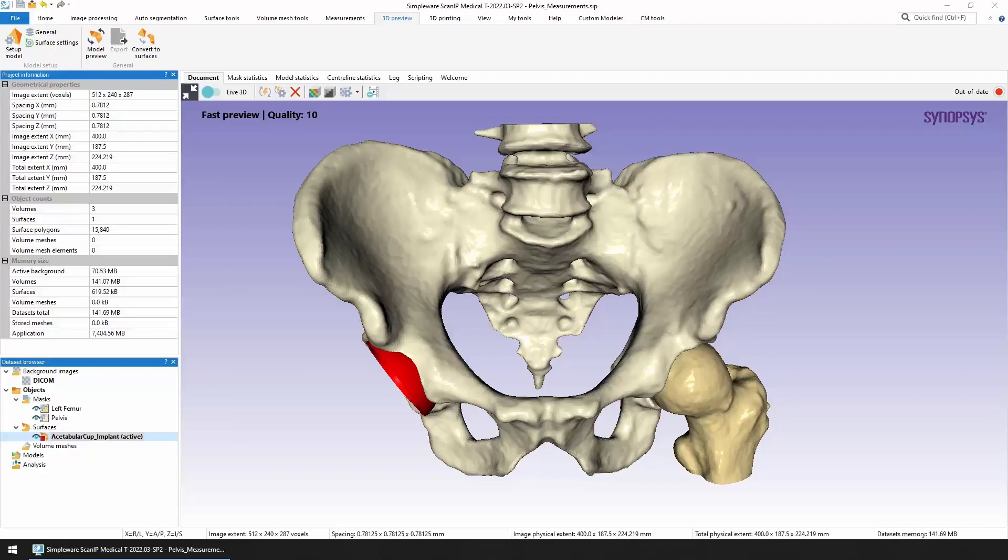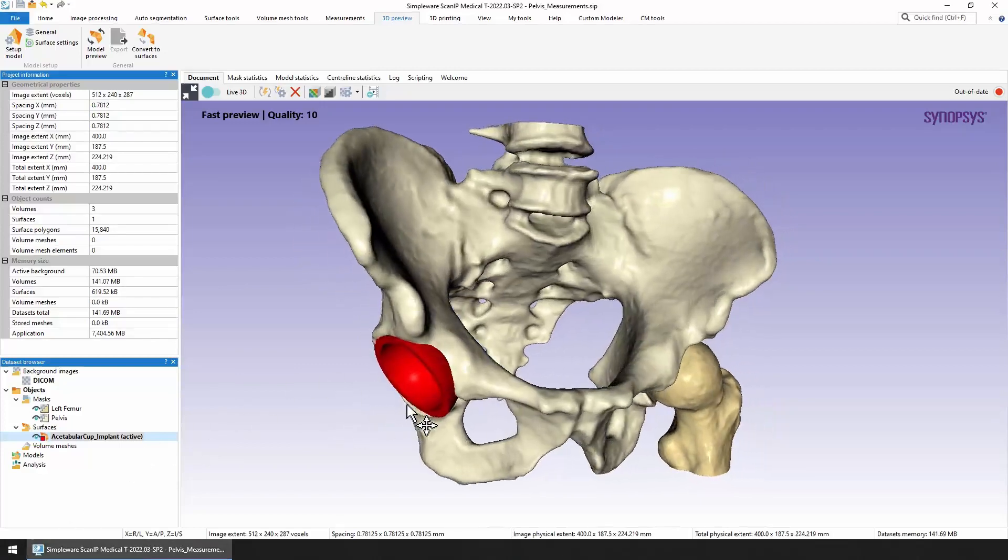Here you can see we have a pelvis and a section of the left femur segmented from image data. These are shown in the dataset browser under the masks heading. You can also see we have a surface showing a very simple mock-up of an acetabular cup, shown in red here.